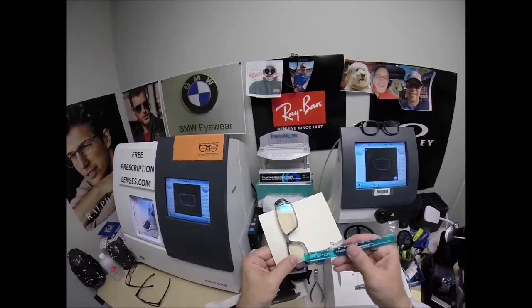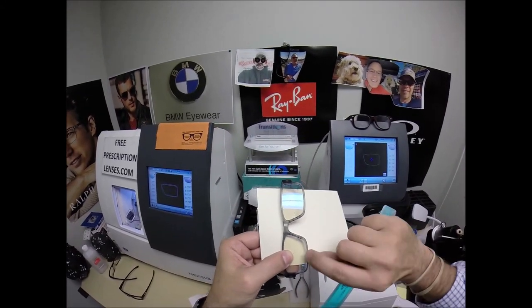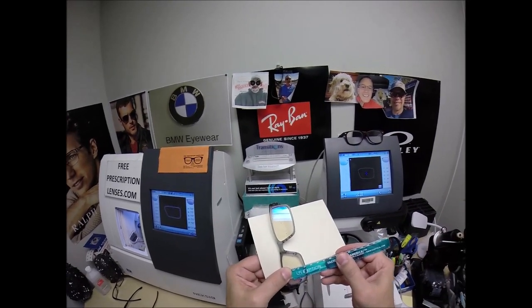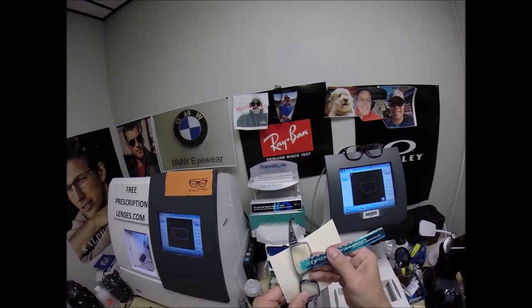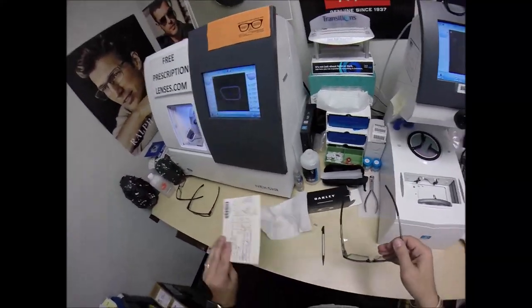This should be 18 millimeters from the center of the middle of the frame, not the bottom of the lens, where the middle of the frame is because of the bevel. We're at 18 millimeters there. 18 millimeters there. This is known as final inspection.